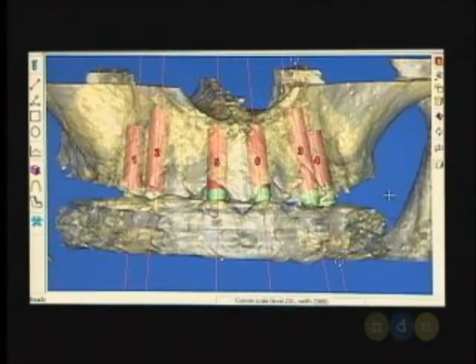What we'd like to do today is really be able to incorporate placing the implants where the bone is, placing it in bone that's of good quality, planning out the abutments inside the restoration, having all the components available, and really being able to take a patient from a removable denture that's been wobbling and moving around the day of surgery and transferring this into a hybrid prosthesis that's very stable and very secure.